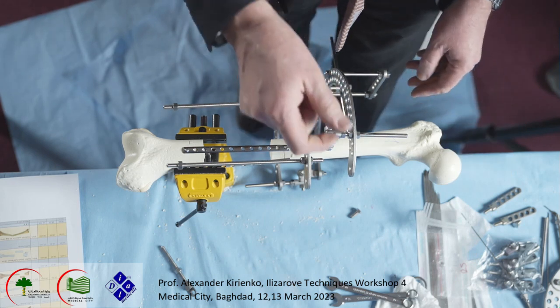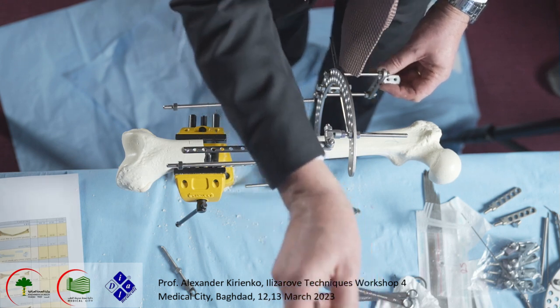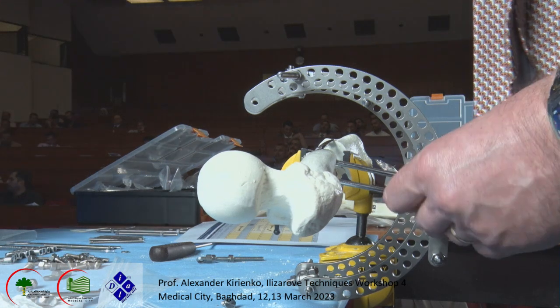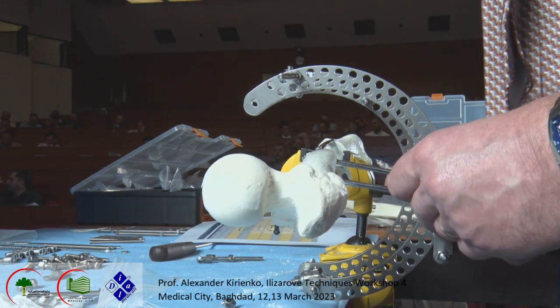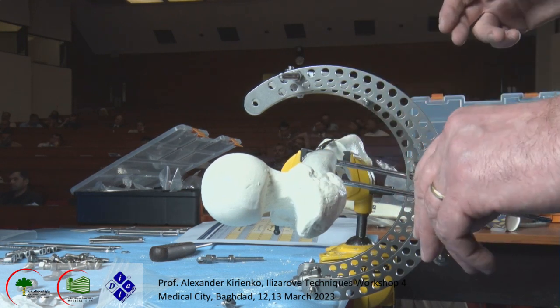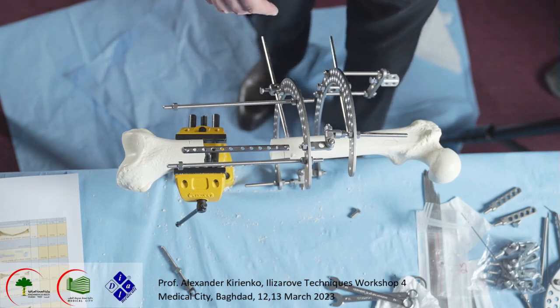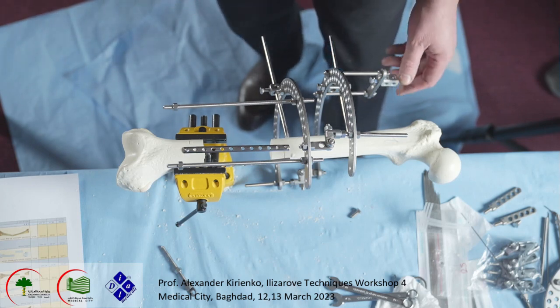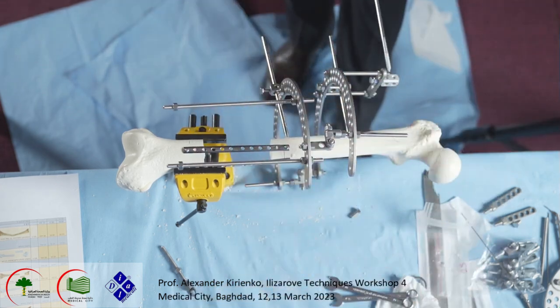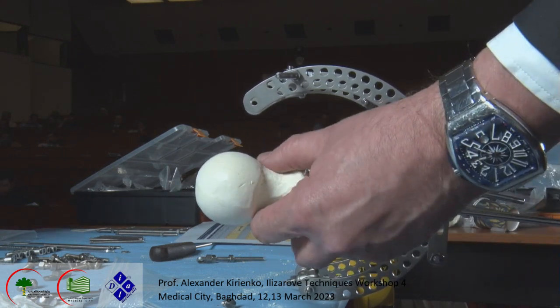Okay, now we put the cube, because it is better to stabilize it. And then I should arrive quite in the trochanteric area, because the proximal part is larger and it will be more stable. Thank you. Okay. And go here.